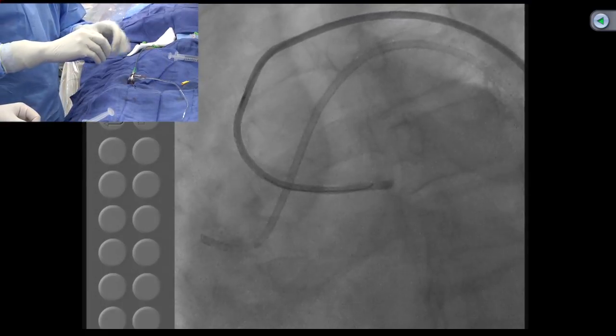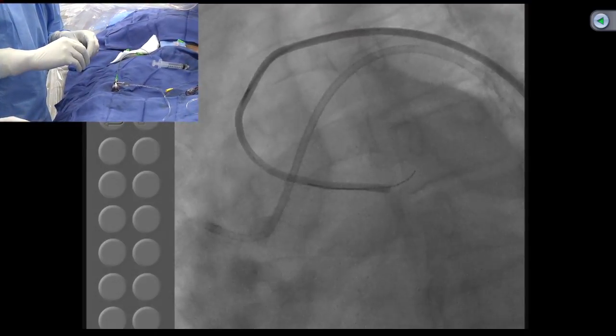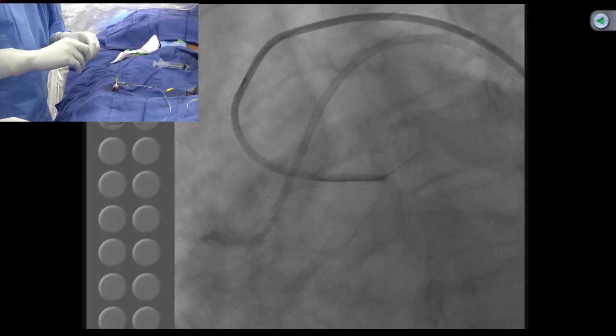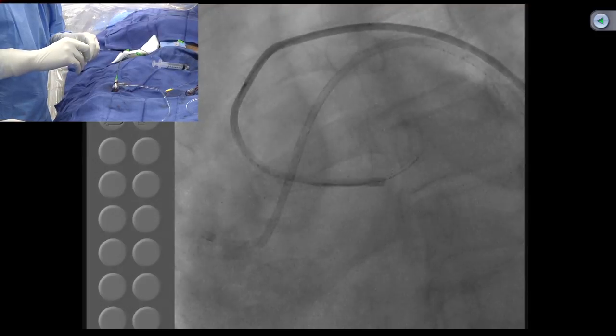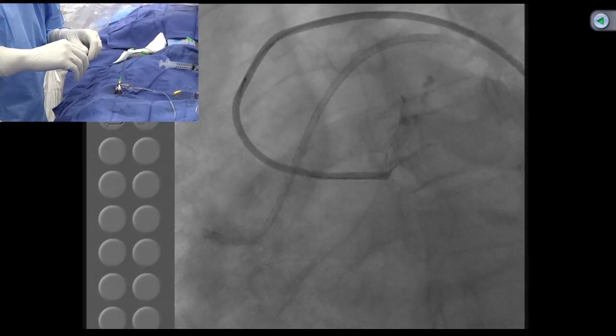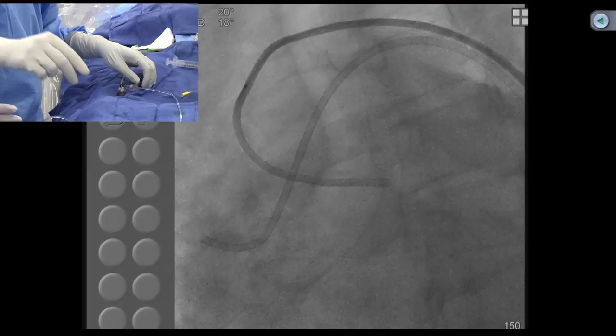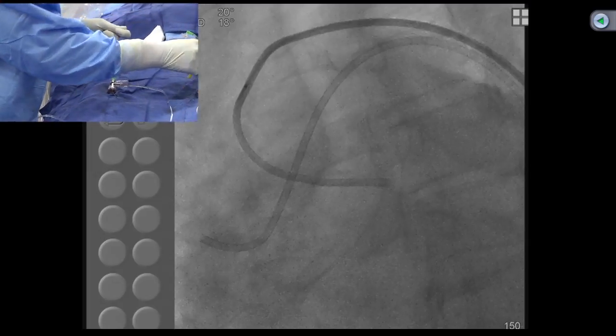Now it looks like the guide may be a little too big here, but let's make a little counterclockwise turn. This is 3.5 VL. Okay, so we may look for a 3 or make a better curve on the 5. Yeah. Samin, a very interesting first question has come.